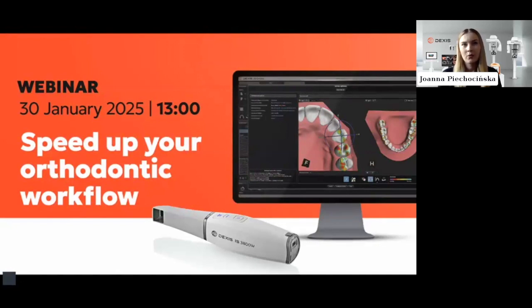Welcome to the webinar during which we'll present orthodontic workflow in IS ScanFlow. And today we also focus on our other software, IS Ortho.